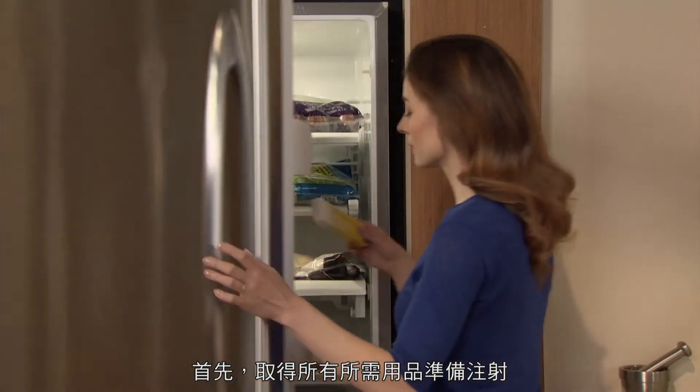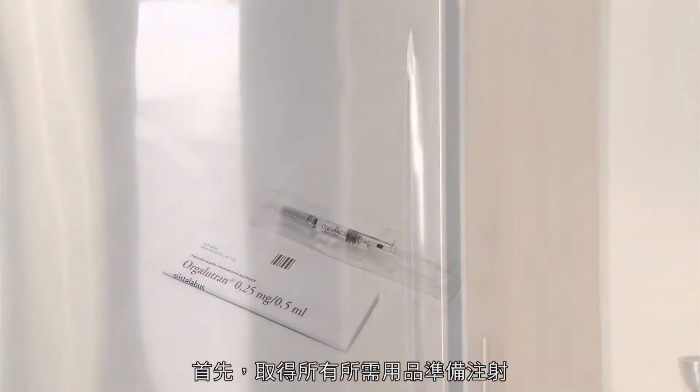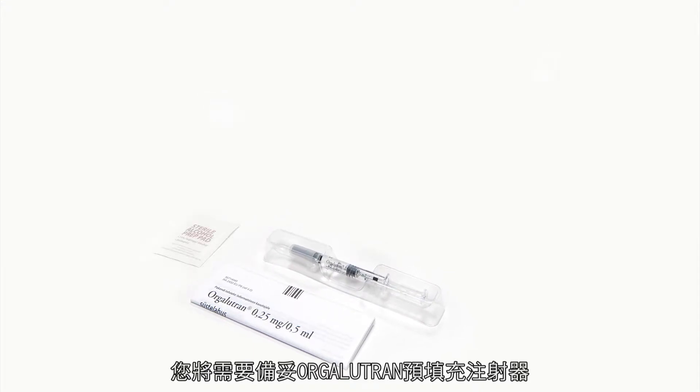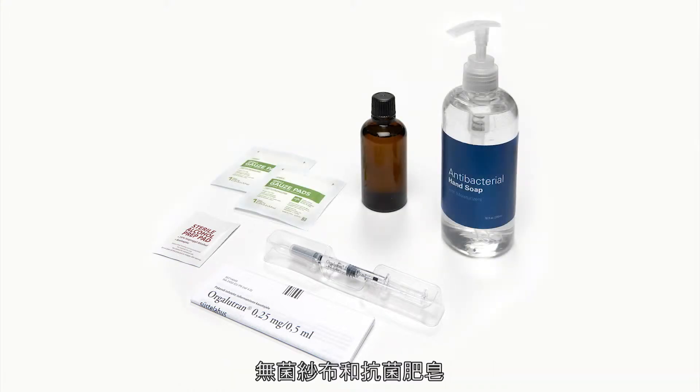First, prepare for your injection by gathering all your supplies together. You will need one Orgalutran pre-filled syringe. You will also need some alcohol swabs or pads, sterile gauze, and antibacterial soap.